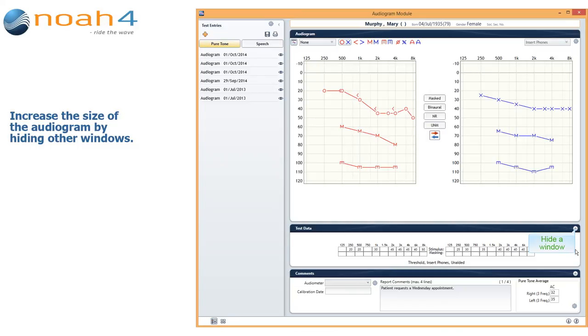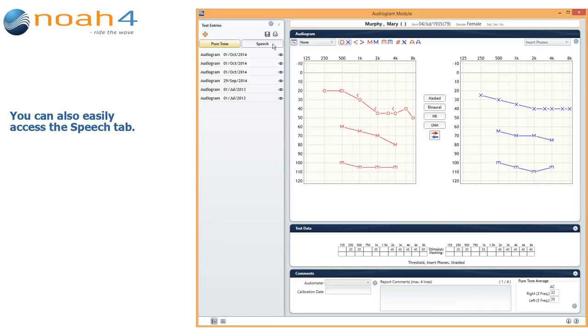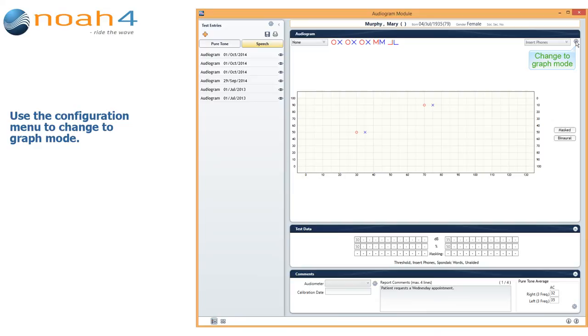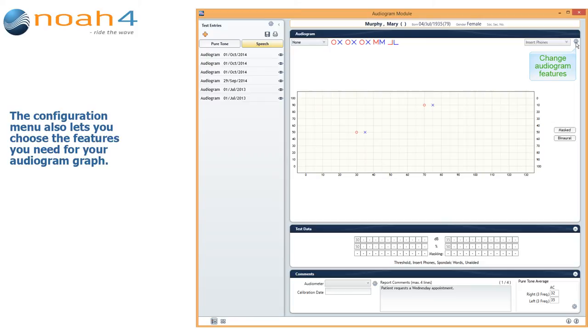You can also easily access the speech tab. And you can use the configuration menu to change to graph mode. The configuration menu also lets you choose the features you need for your audiogram graph.